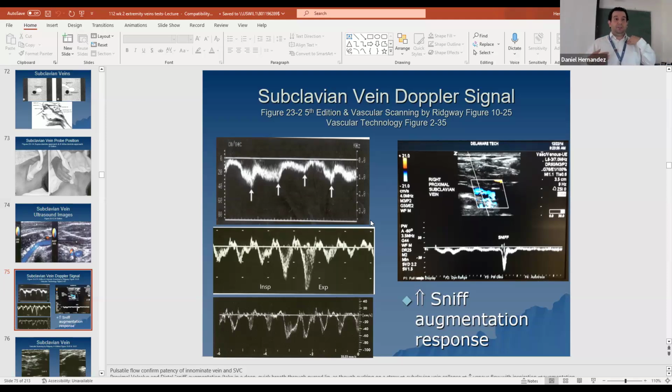This one is very pulsatile on the asymptomatic side. On the symptomatic side, it looks very continuous, with much less pulsatility and phasicity. Something might be blocking, obstructing, or compressing that central vessel that we're not seeing. We need to investigate further. The doctors need to order another exam, or we need to take a closer look and try to image the brachiocephalic if possible.